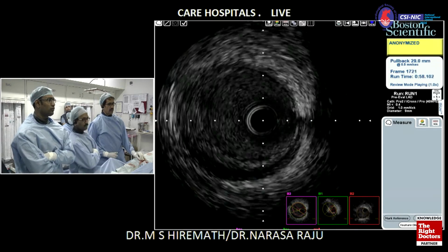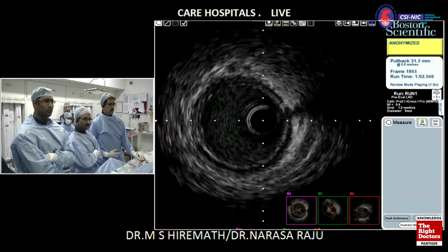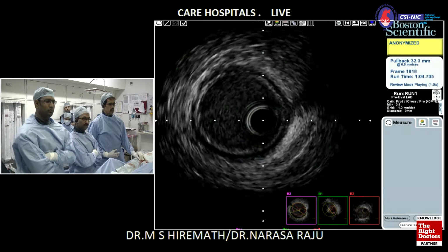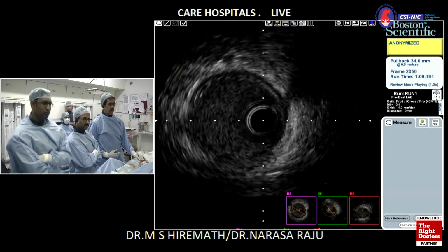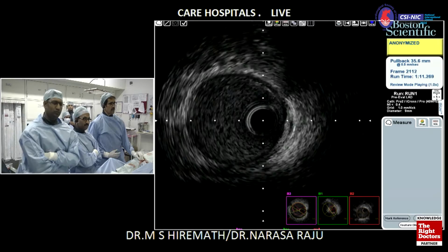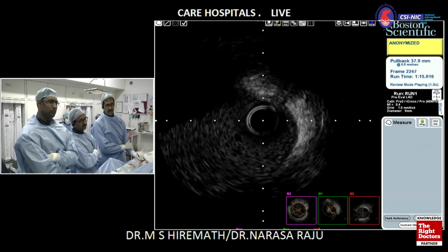And the diameter of the left main, I think that's going to be an important issue because we absolutely need to oppose the stent to the vessel wall, and the diameter of left main in the mid shaft and ostial area is nearing 5.